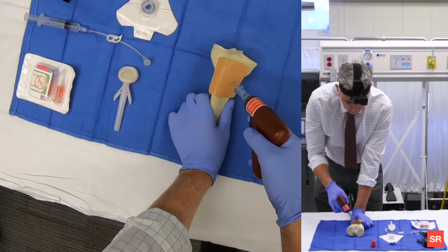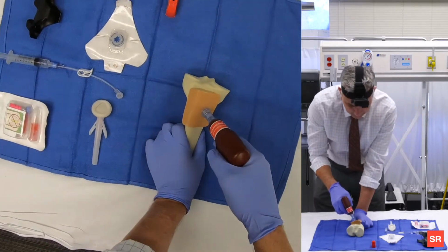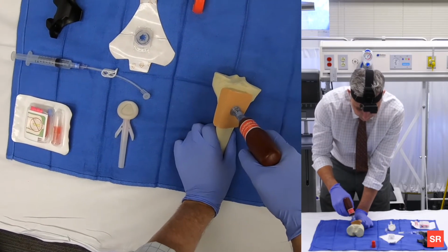I'm now going to hold the leg in position and go to my previously decided area. I'm going to apply it at a 90-degree angle. I'm going to push through the skin. I've now hit the bone. I see that there is one mark out, so I'm able to turn on the drill and advance it into the bone. Now I've advanced it into the bone.